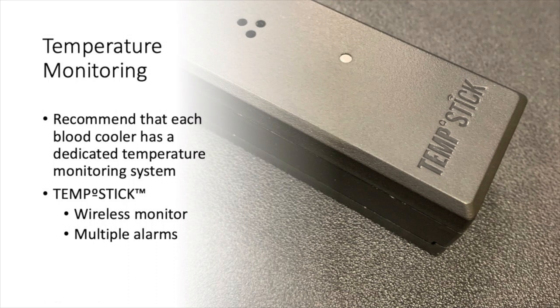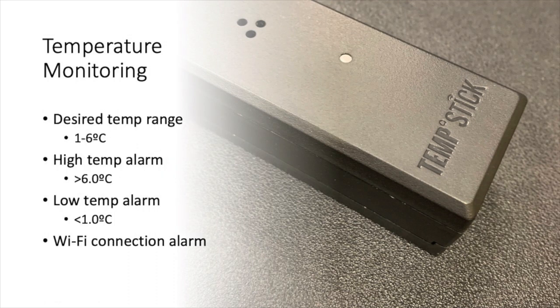It is the Regional Whole Blood Committee's recommendation that each blood cooler has a dedicated temperature monitoring system in place. Pictured here is the TempStick, which offers wireless monitoring along with multiple programmable alarms. So what temperatures do we want to keep our whole blood at? Our desired temperature range is 1 to 6 degrees centigrade.